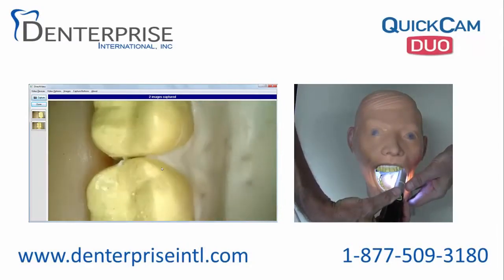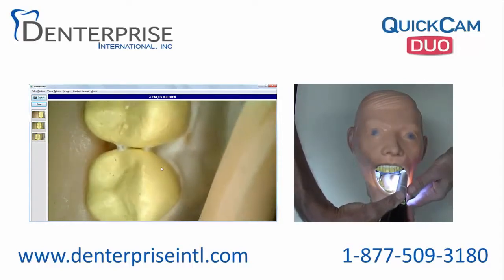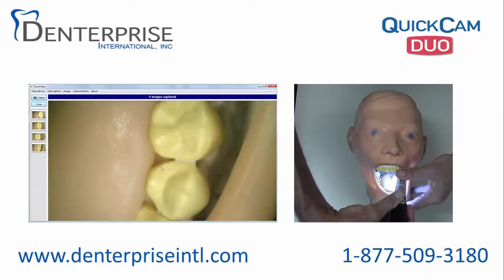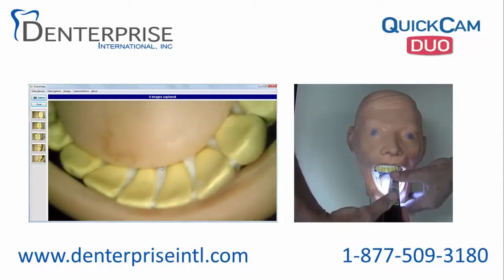Using a similar hold on the camera, the thumb is on focus and the index finger is on the capture button. It is very simple to aim the device, to focus it, and then capture each image.